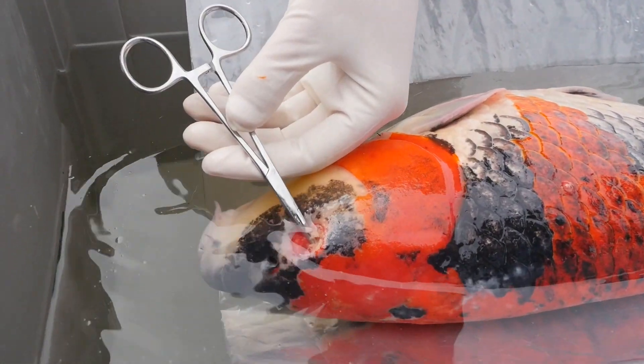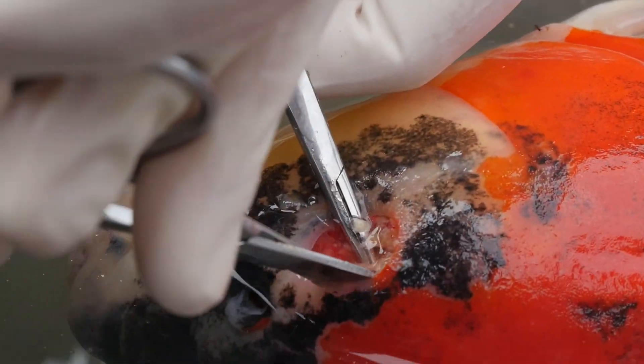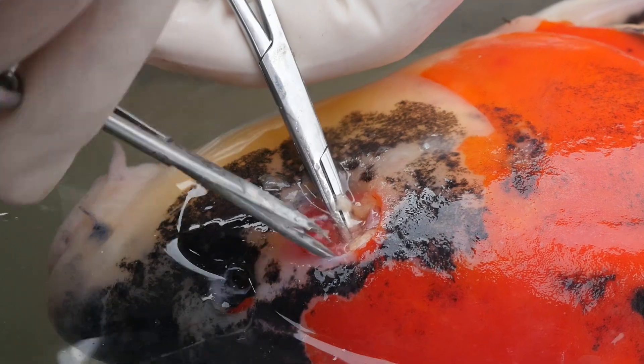I have all those vessels and nerves clamped off. I'm just going to clean up some of this tissue. This is just fat and connective tissue.